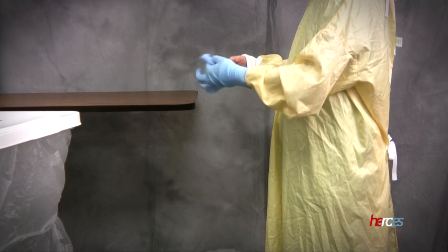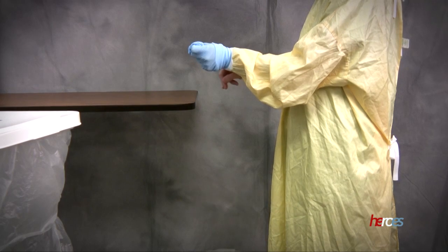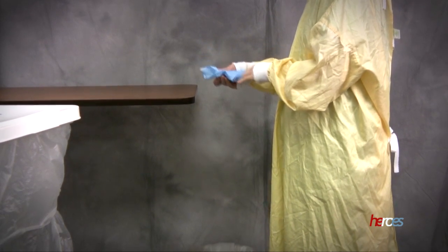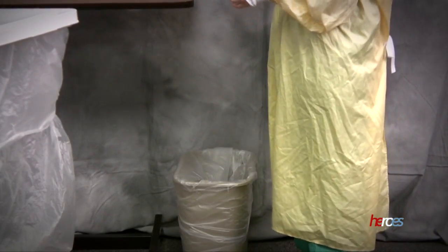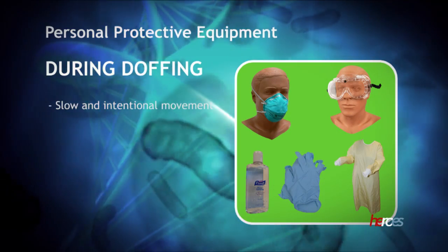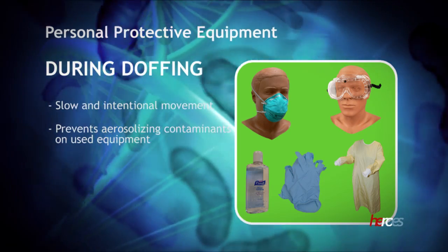Hold the removed glove in the gloved hand, then slide a finger of the ungloved hand under the remaining glove, touching its clean side only, and gently peel the second glove off over the first glove. Discard the gloves in the trash. All movements in doffing should be slow and intentional to prevent the aerosolizing of any contaminant on the used equipment.